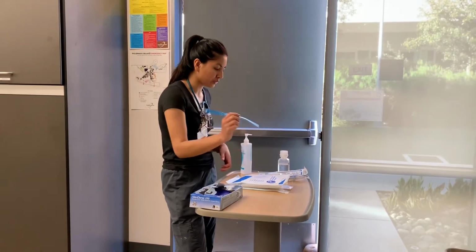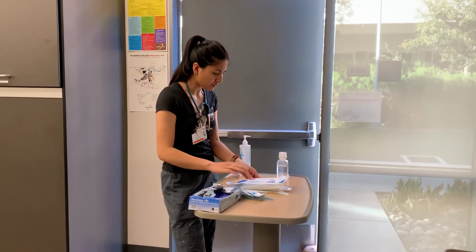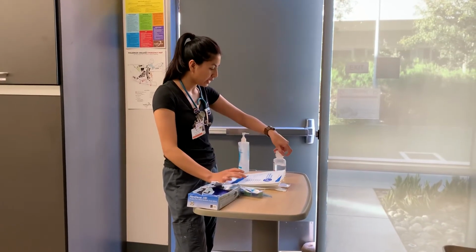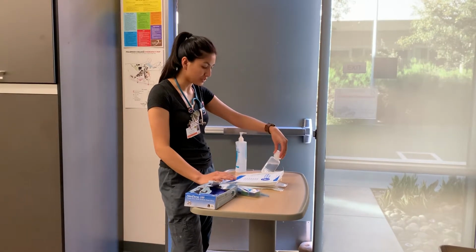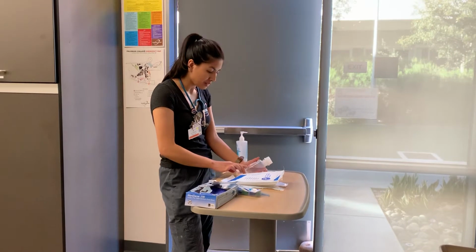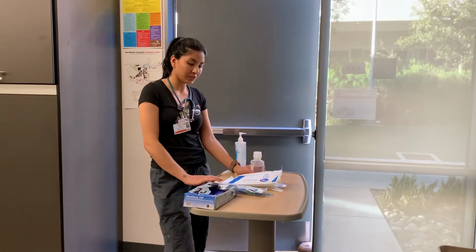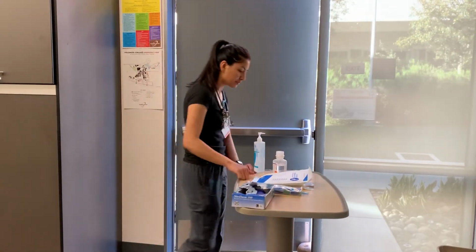So I'm going to get an oral suction and an oral care tray kit, a suction catheter kit, and a normal saline, sterile normal saline. I'm going to check the expiration on everything. This is good. These two say that they're sterile until opened or damaged, so everything looks good. I'm going to go in the room.